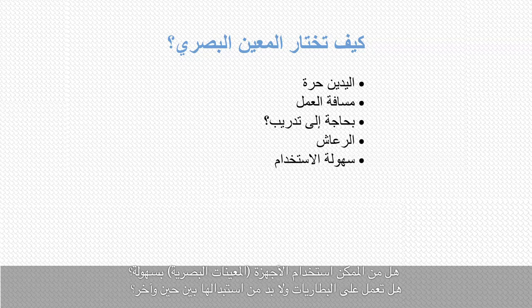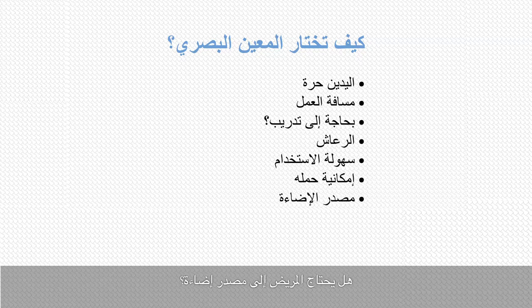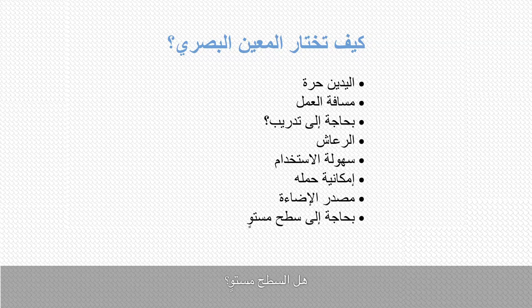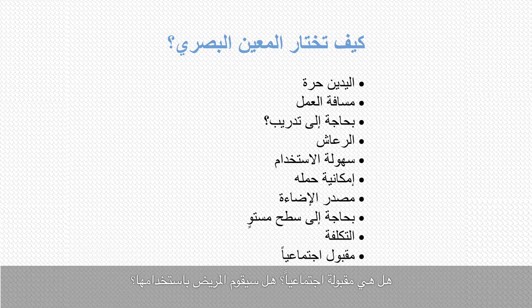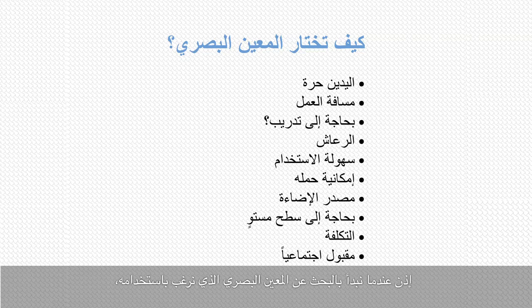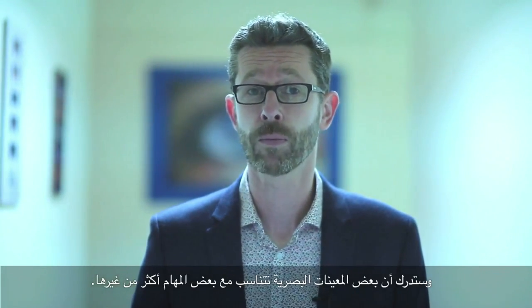Are the devices able to be used easily? Do they need to have batteries in them that need to be changed? Are they portable? Does the patient need a lighting source? Is the surface flat? How expensive is the device? Are they socially acceptable? Is our patient going to be using them? So we need to start thinking about some of these things when we start thinking about which devices we may want to use. Over the course of the next few films, we'll start to show you some devices, and you can start to think how some of these devices may be more appropriate for some tasks compared with others.